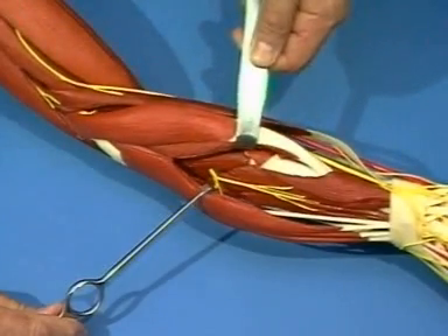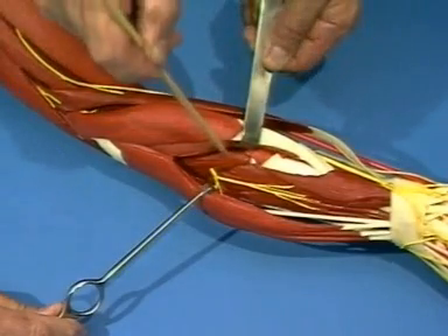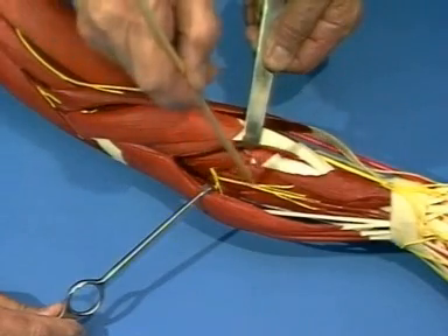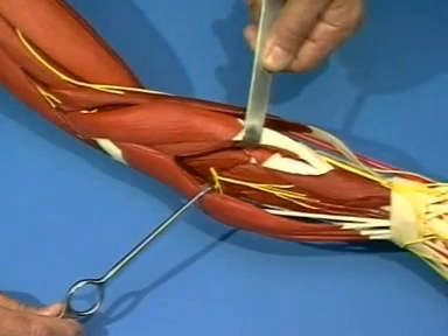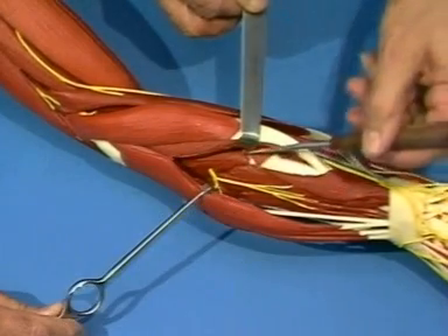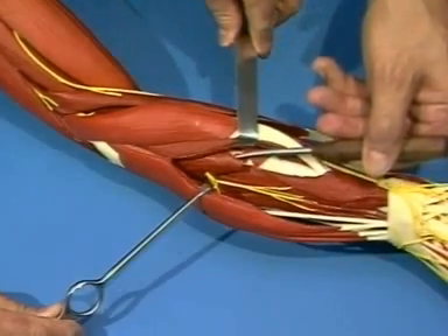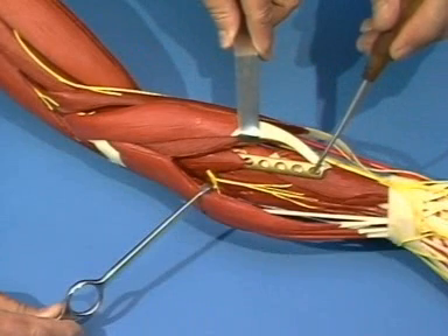This exposes the supinator muscle and the deep branch of the radial nerve, which emerges from the supinator channel and runs to the extensor digitorum communis, which it supplies. The muscle and nerve may be lifted from the radius, allowing a plate to be inserted in a distal to proximal direction beneath the supinator muscle and the deep branch of the radial nerve.